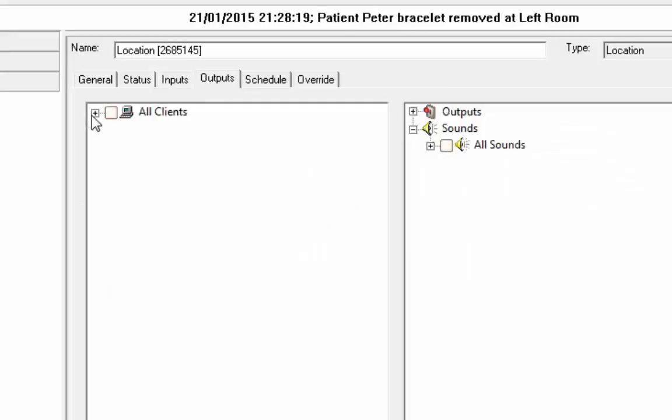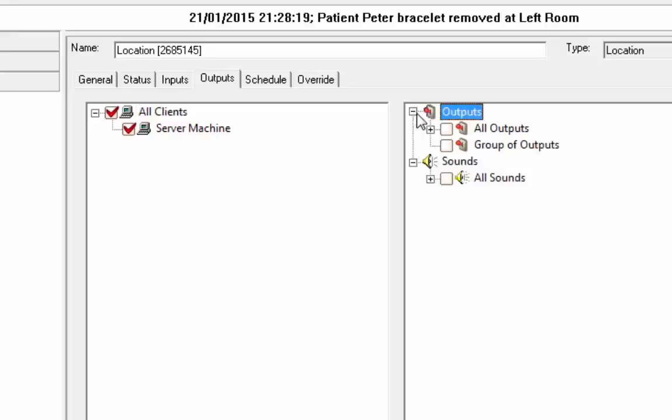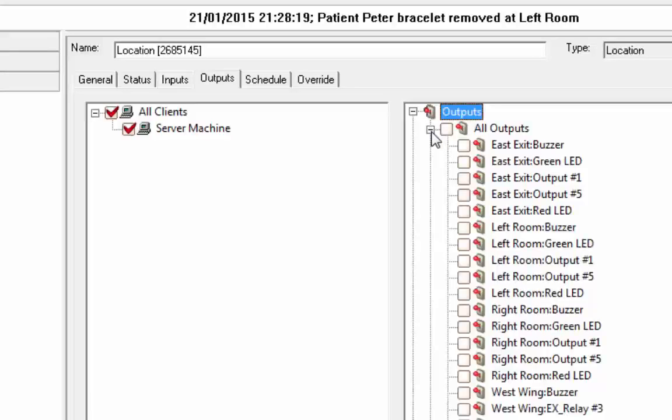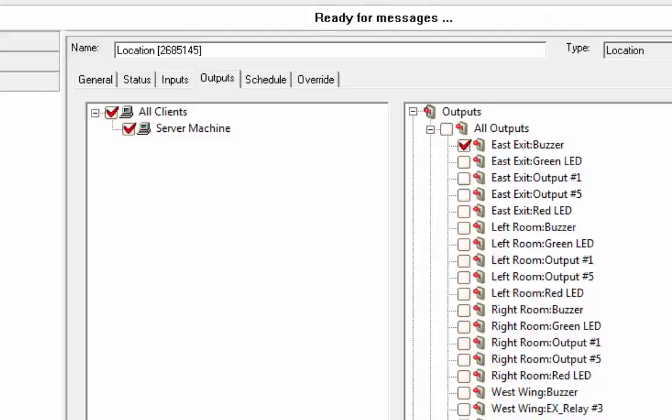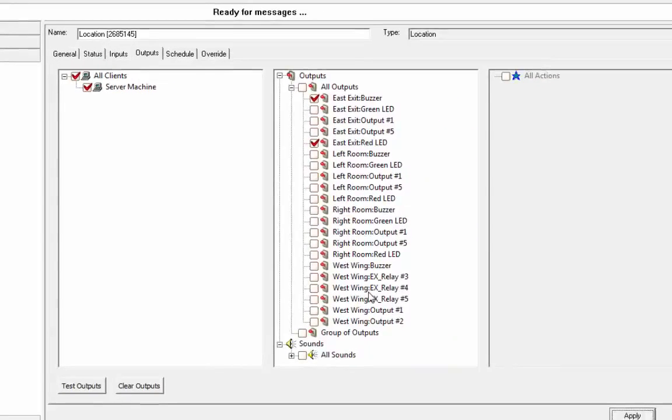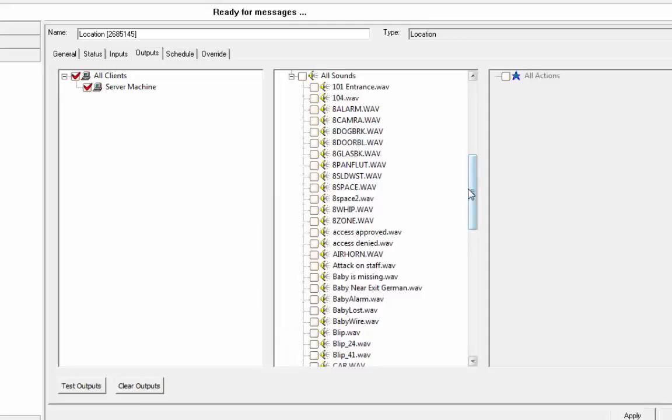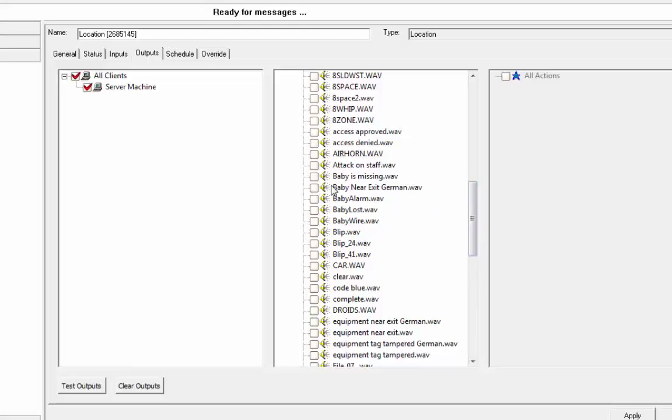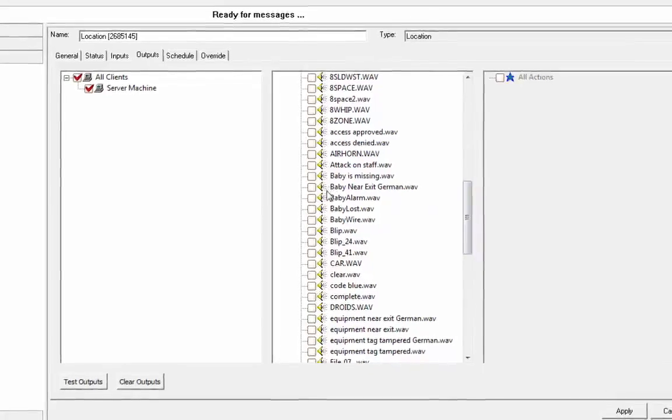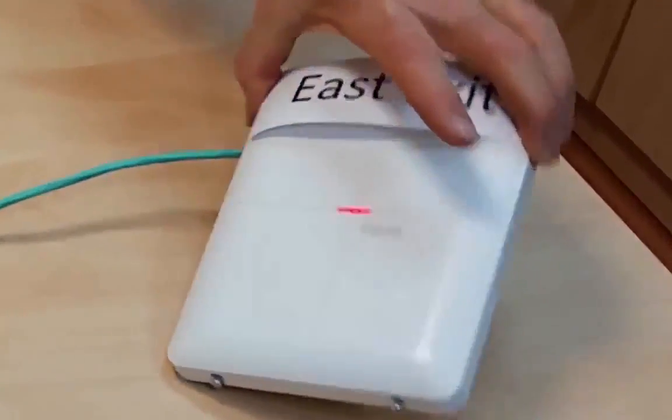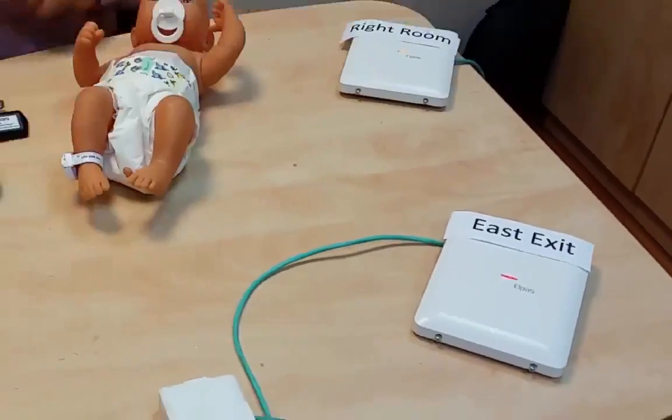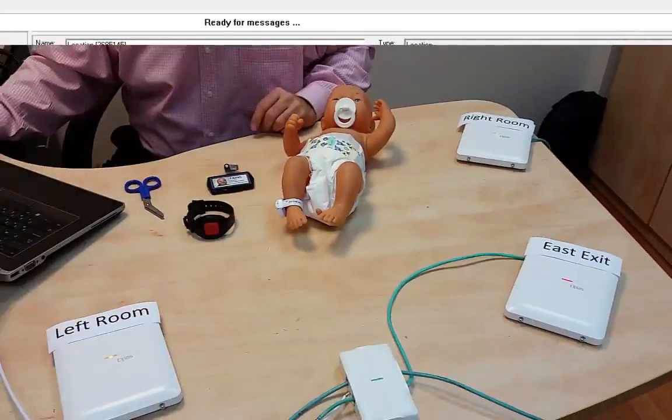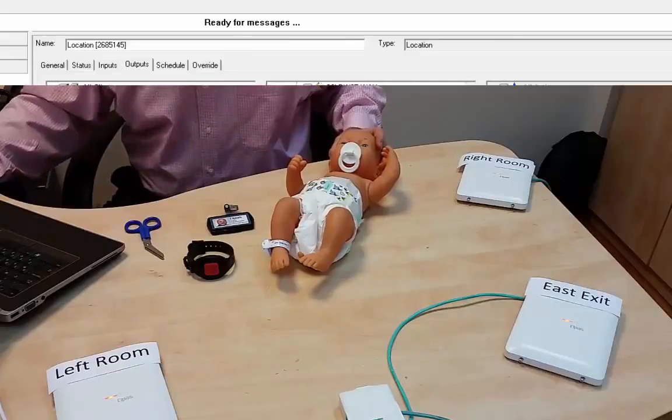As far as the output goes, we are going to send it to all of the clients. We're going to set the buzzer on the east exit. And let's also turn on the red light on the east exit, the red LED. And we're going to play a file that says baby near exit, baby alarm. Essentially, I hear the buzz, it turns red, and I got the message. I'm going to clear that. So, this is called the baby near exit alert.